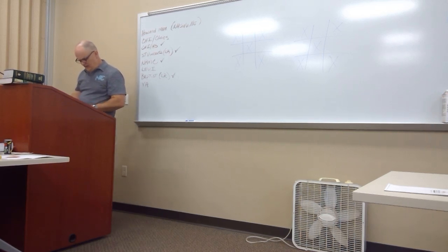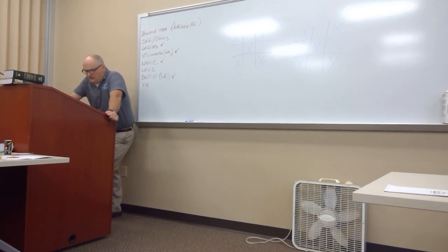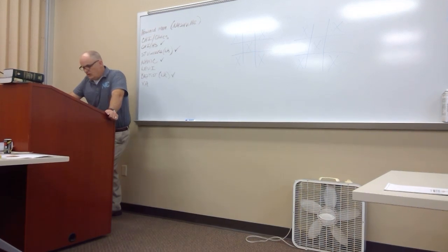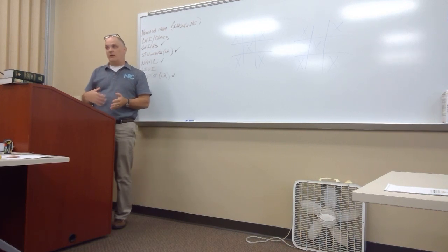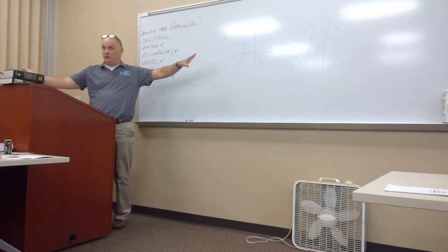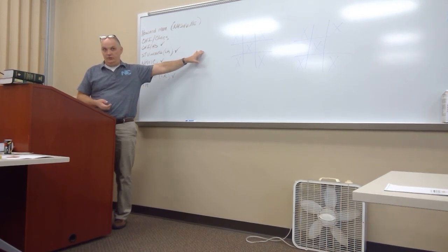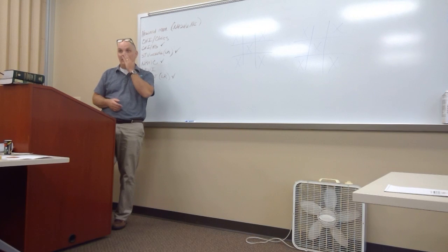We've already done number 9. Number 10, a CSF white blood cell count would be diluted with which of the following? Acetic acid. And why do we use acetic acid? Lysis of red blood cells. Now, one thing I didn't talk to you about today is you can actually do a total cell count on CSF. Of course, if you want the total cell count, that includes red blood cells, right? So you would not dilute it with acetic acid. If you had to dilute it, you would just dilute it with saline, but you probably wouldn't be able to differentiate the white from the reds.